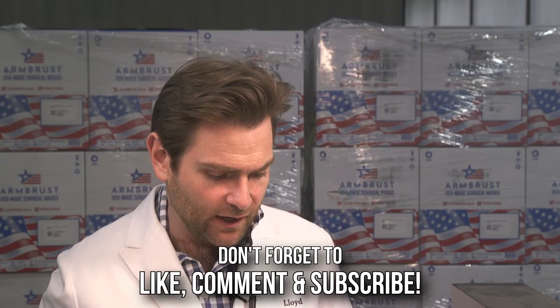Lastly, I'm including two Benny Hall Black NIOSH N95s for you to test. I haven't seen you test anything in this brand. Thank you for your service, Lloyd Armbrust.